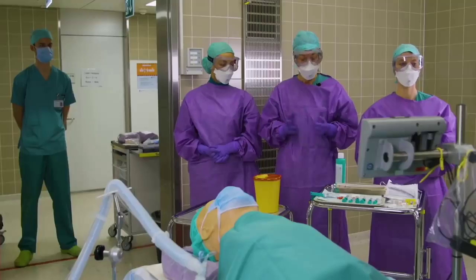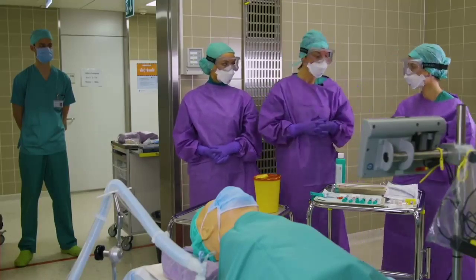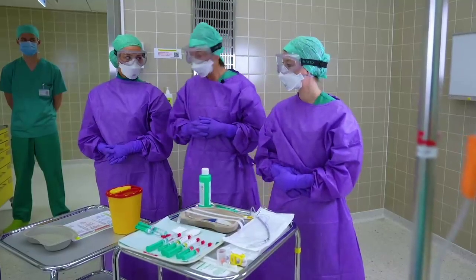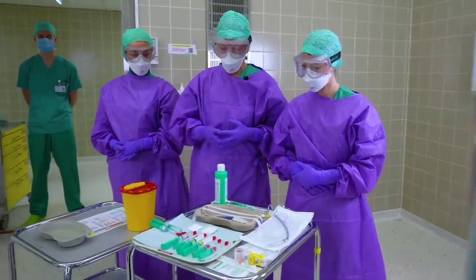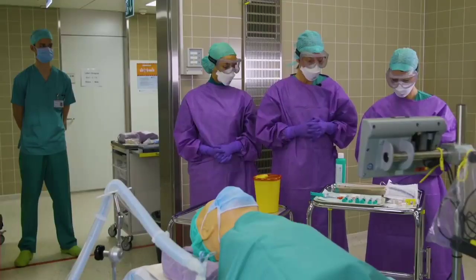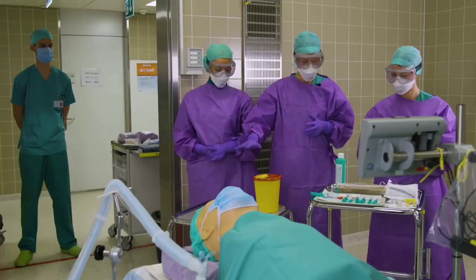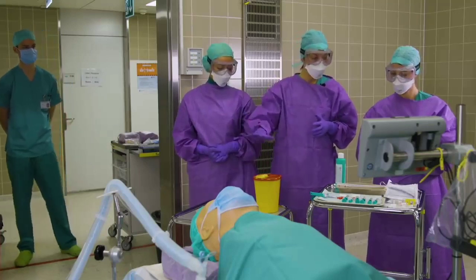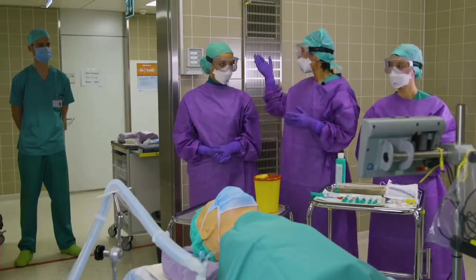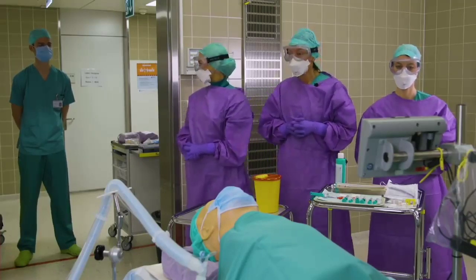For the planning phase, as you can see, we are all donned in protective gear according to your local SOPs. We did our body check and we deemed each other appropriate for this procedure. For induction, we have our medications on the tray as well as our airway materials, including an endotracheal tube with a stylet in place and our video laryngoscope. Next to the induction table, we have our dirty tray for dirty materials. It's also important to have a trash bin next to the patient so you can drop dirty articles right into it. Outside, we have Tim, who is our clean person and jumper — in case we need medications or airway material, he will be able to hand them to us.